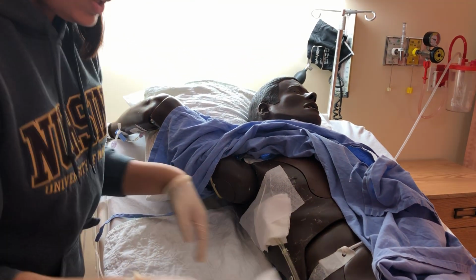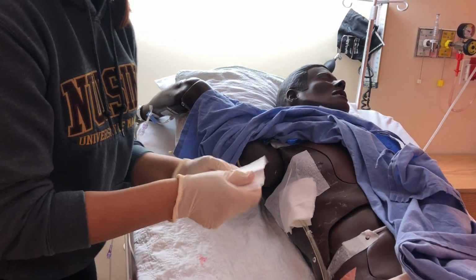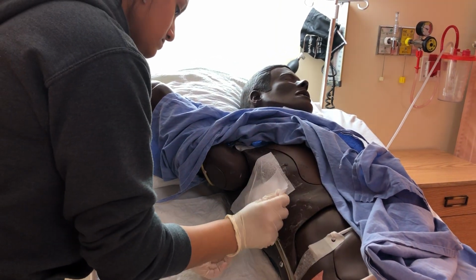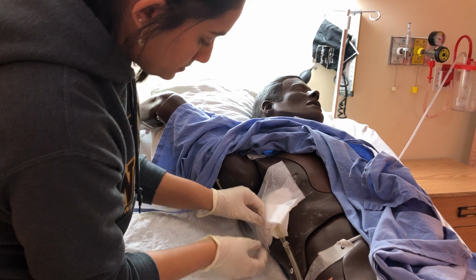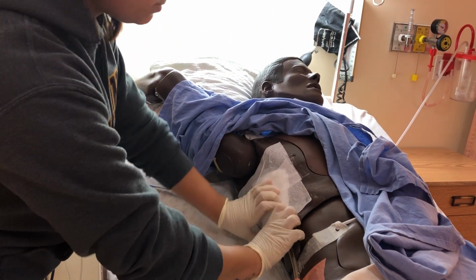Okay, and then I'm going to use another mefix. And this one has my date, time, and signature on it. So just being sure to tent the piece.